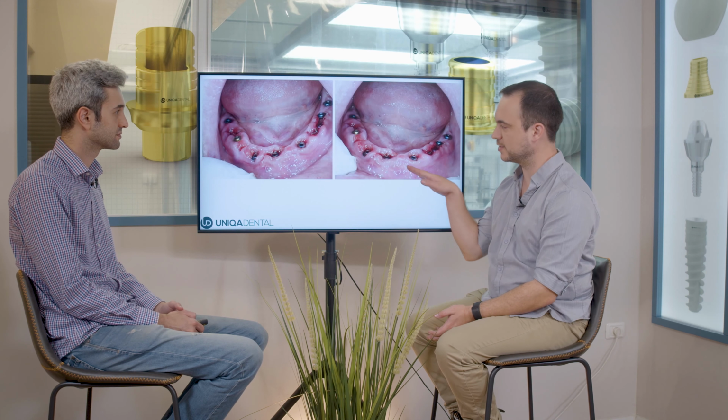Now, after some healing, we can see that the gingiva is starting to form up. You can see the concavity of the crowns. We also made a new temporary bridge, and you can see that the occlusion is much better. Still, maybe we need to have some correction of the central line. It's something that takes a process. You can't have one temporary bridge and in this one temporary bridge get everything perfect and go right to the zirconia. Only in fairy tales.